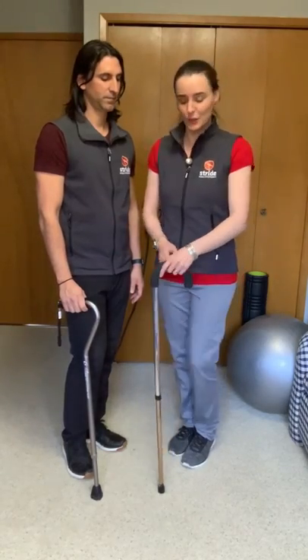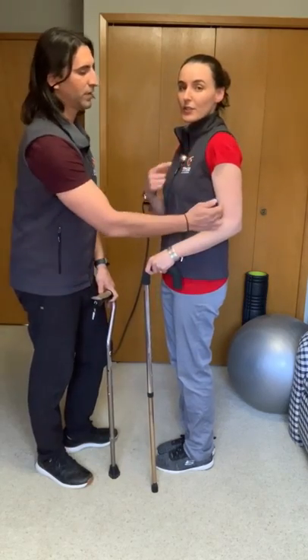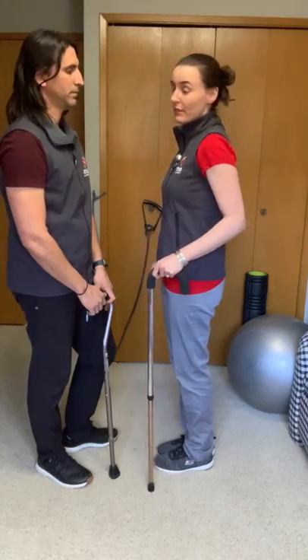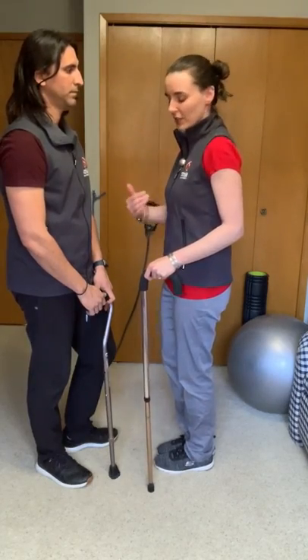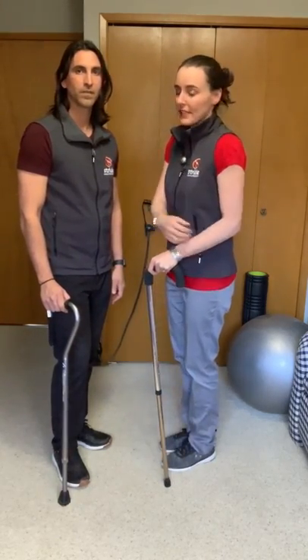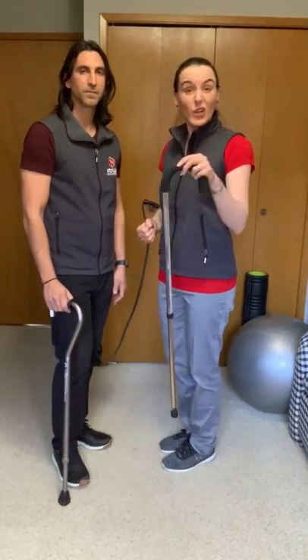My cane is too tall for me. You can see here I have a very bent arm — it's actually almost 90 degrees. So that's too much, that's not safe. You'll see as I stand, my shoulder comes up, which can cause injury, and the muscles in my arm will get very fatigued because they're in an almost bent position. So this is too tall.